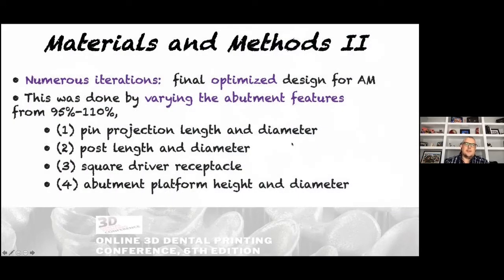So the second part of the materials and methods was basically trying to design and print. We want something tangible to hold the abutment, okay? So we had to decide on lengths. We have to tailor this. So just like when you go to be tailored for a suit or a dress, you have to take measurements, you have to create the product and then try it on.